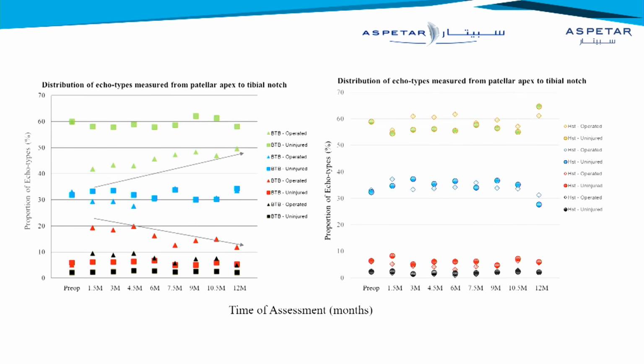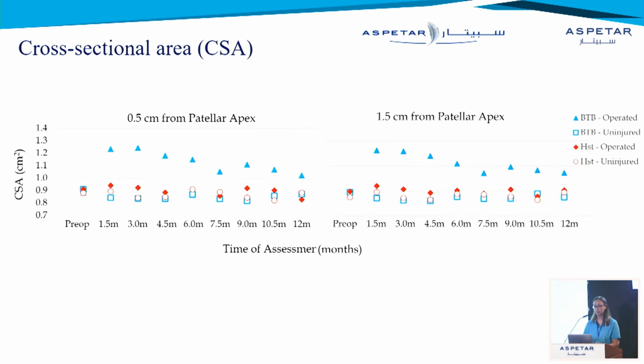And well, what happened in there? And that was in 2 different areas of the tendon. Cool. While for the cross-sectional area, the tendon remained thicker than the uninvolved, unoperated tendon in both areas, as would be expected and in agreement with the literature.